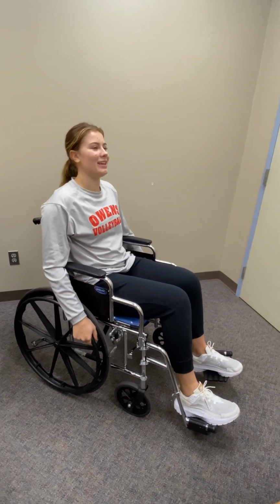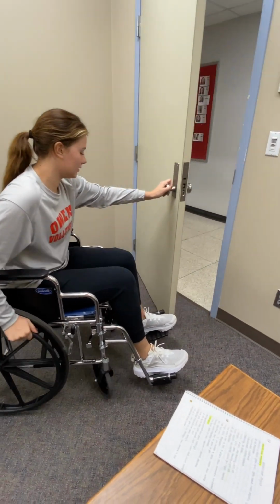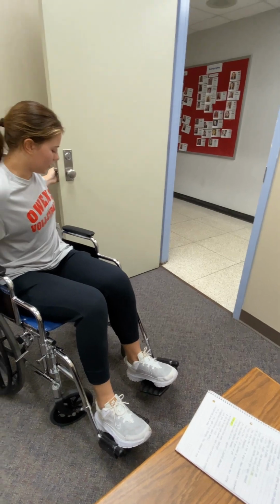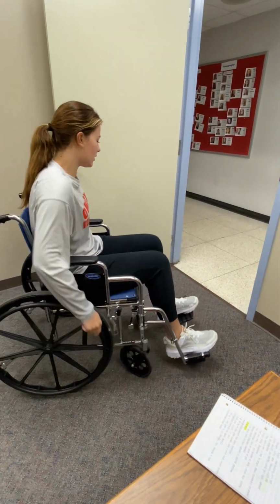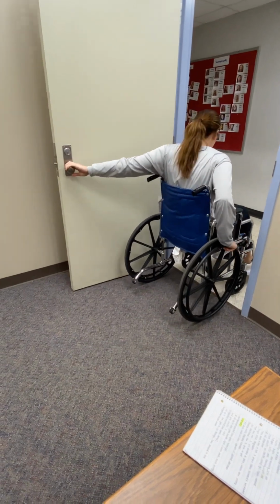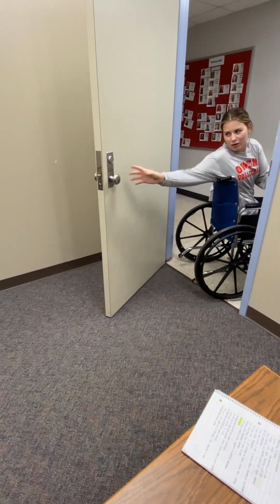Next is independent with the door opening towards the patient. So you go up to the door, grab the doorknob, open it. You go through the door. And before you go all the way through, you grab the handle to close it.